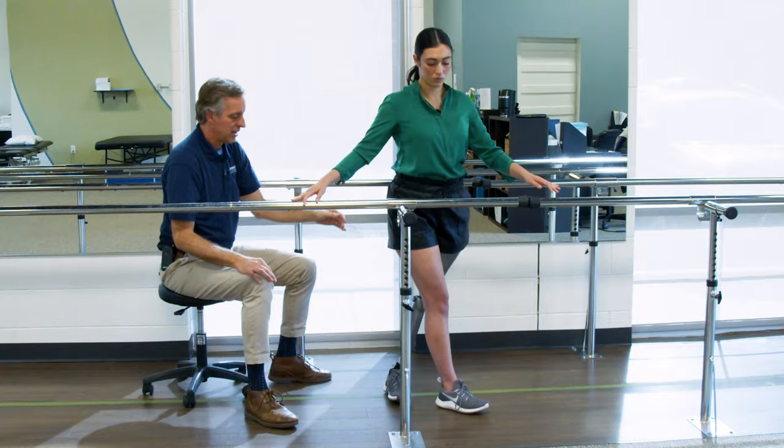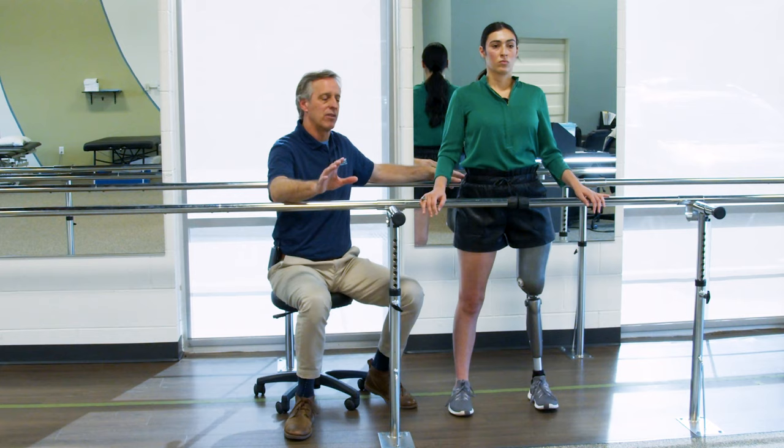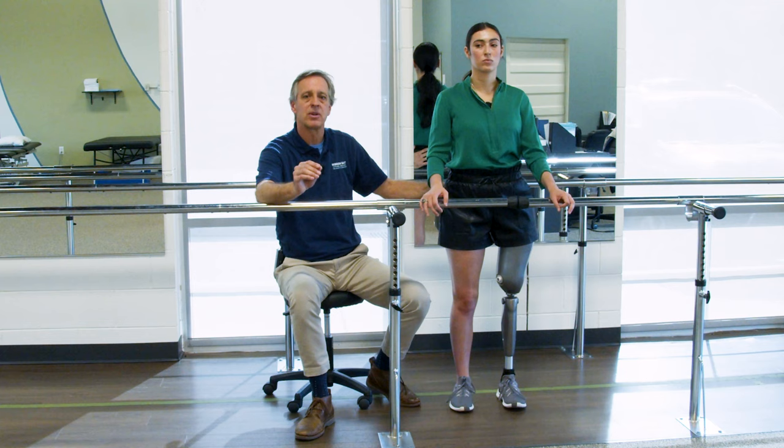There you go, right there, and hold up right there. That's what's so important about this drill. Why is braiding so important? You say, well, do I have an 80-year-old do this? Yes, they may not do it at the same level or crossover as far, but it's very important.